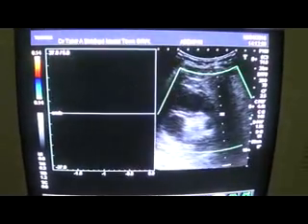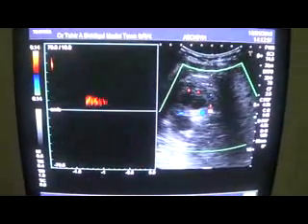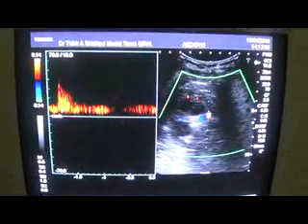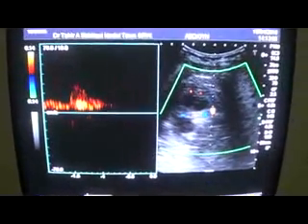I think with normal renal waveform and pulsatility index. Thank you very much.